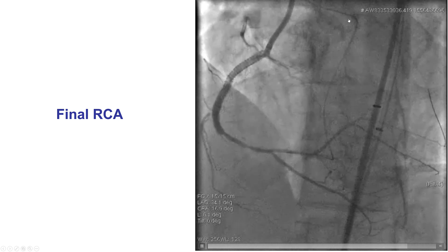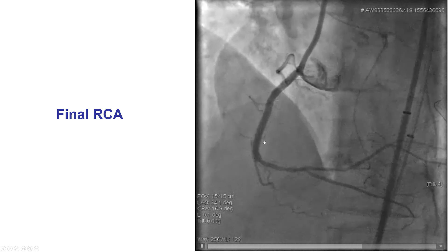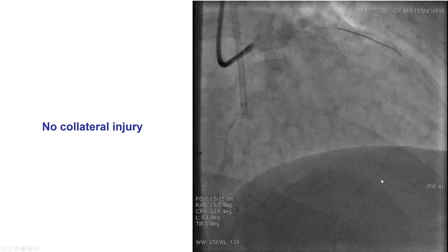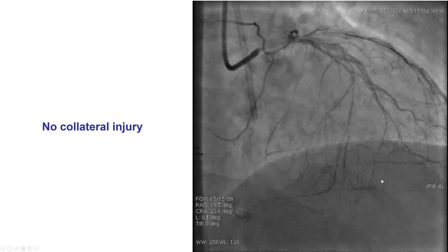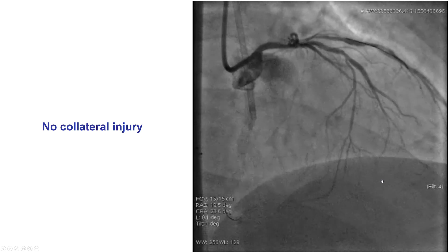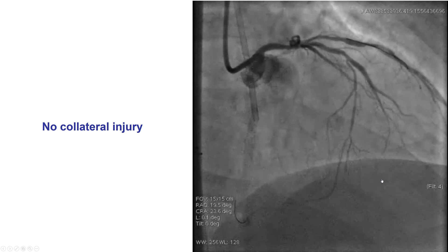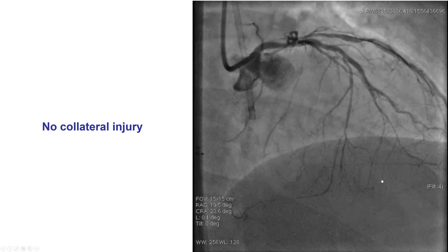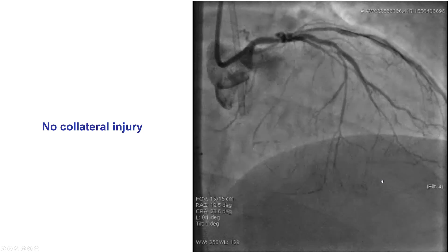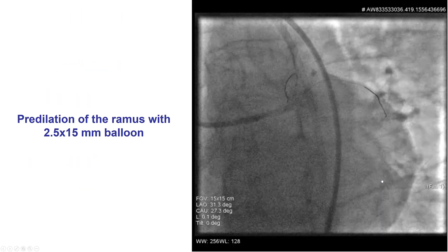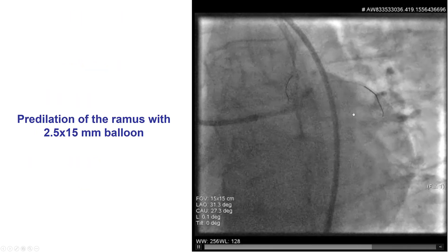We had the guide disengaged from the left main, no ischemia issues during the process, and we achieved re-canalization of the right coronary artery. We debated whether to complete the revascularization at this session or stage it. The decision was made to proceed because we had not used too much contrast or radiation. So we proceeded to treat the distal left main trifurcation.